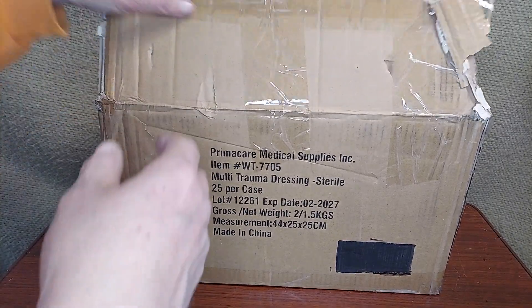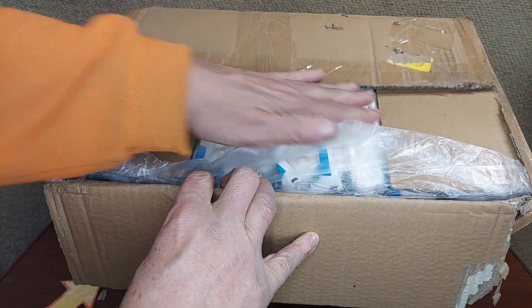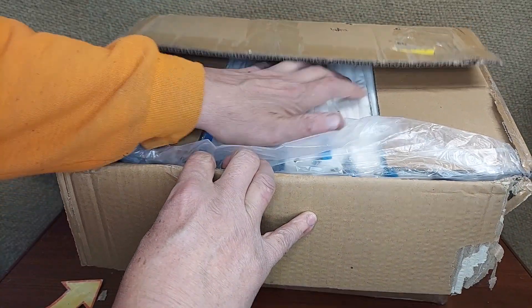You certainly want to be careful when you open this, because the dressings are right here at the top. If you were to cut too deeply with your razor, you're going to cut into every single one of these.